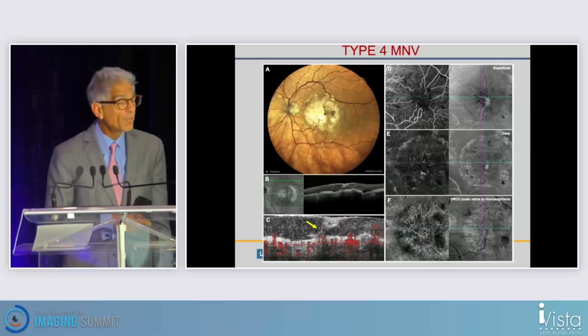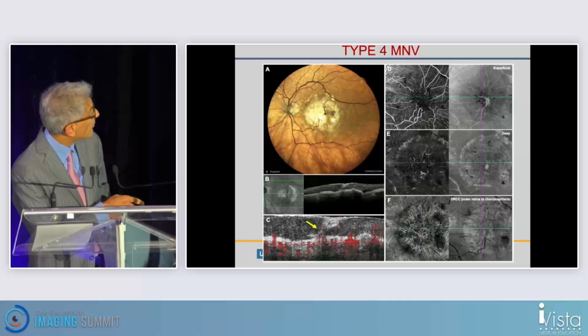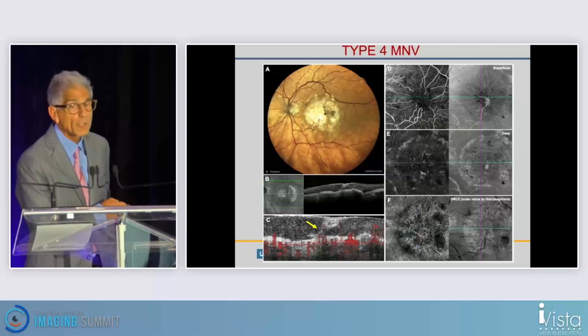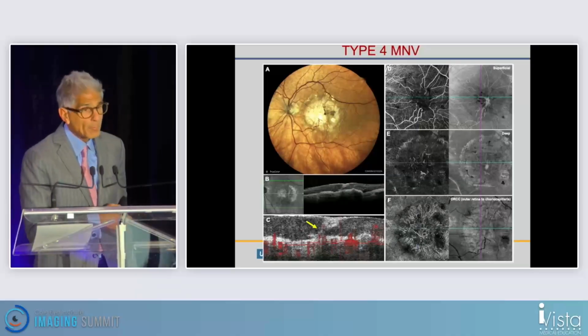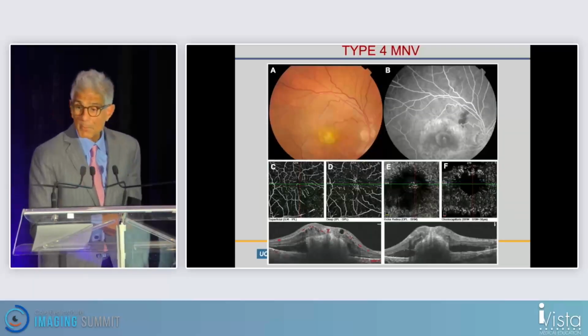posterior hyaloidal fibrosis. And you can see evidence of this with the OCTA, choroidal neovascularization in the subretinal compartment, what we refer to as type 2, and then intraretinal neovascularization, and then growing all the way up into the hyaloidal space. And these patients had particularly poor prognosis with these disciform scars that evolved very quickly, and often had poor vision even on presentation, being treatment naive.